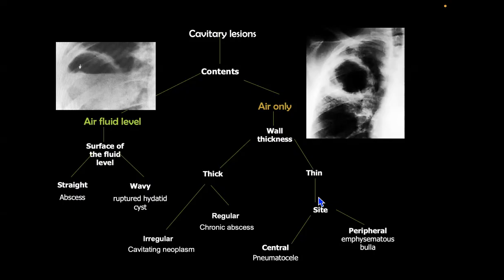If the patient has a central lesion and I put the probe, definitely I'm going to see nothing. The second thing, we concentrate on fluid-containing pathologies and consolidations rather than cavities and those things. The most important thing is the location, because if we have a central location and a structure totally surrounded by gas, we don't see anything.